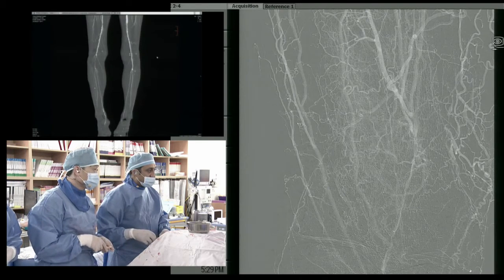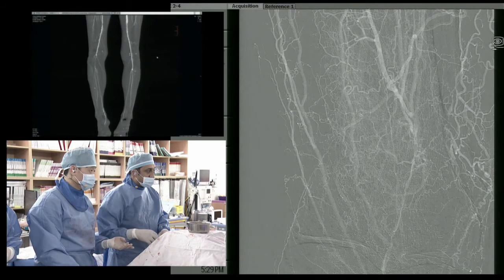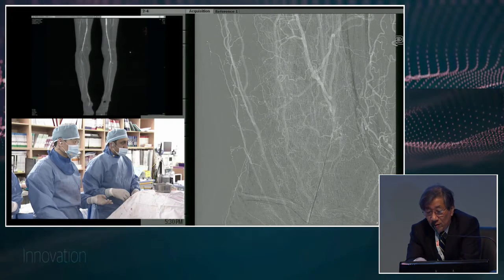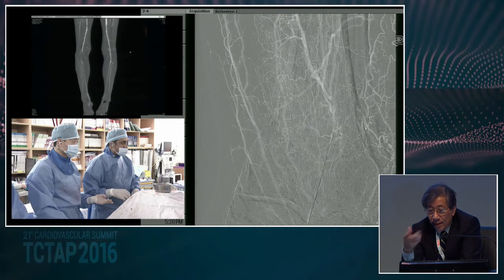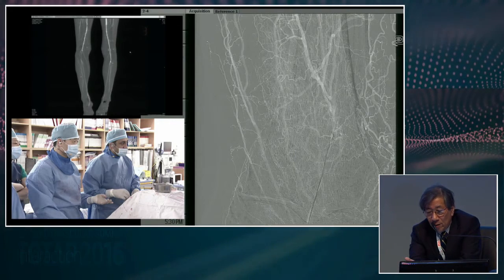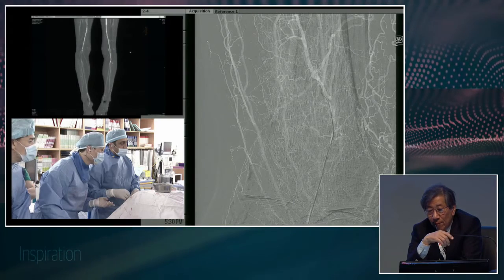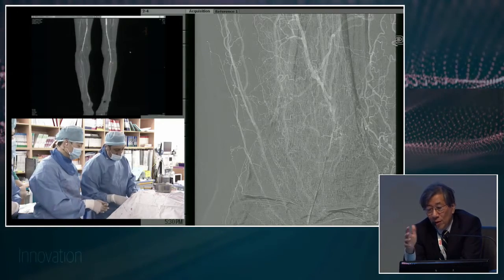So, Dr. Yokoi, how would you look at something like this from a technical point of view? Injecting from the proximal catheter, popliteal artery, there are lots of collaterals. So you have to select the catheter proximal to the occluded segment, and we use a 1 cc microsyringe and inject these vessels, and we'll see, probably it's dissected. And so we have to think about the timing too. Now he crossed, maybe not. And maybe we'll switch to the distal puncture, or it's about timing.